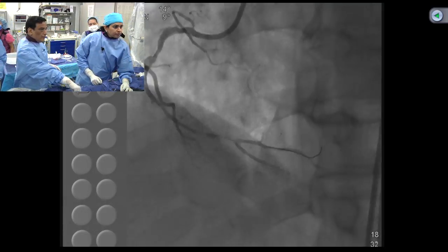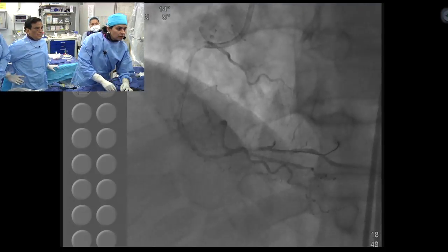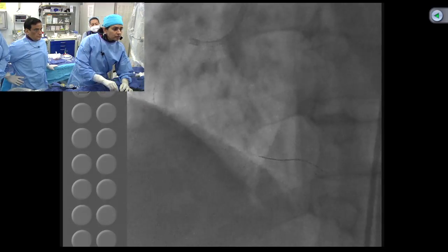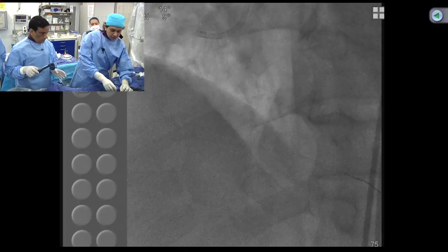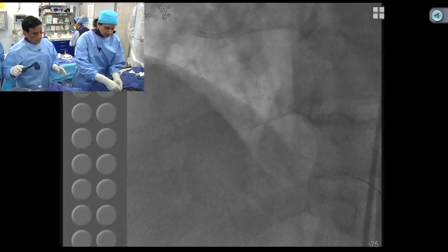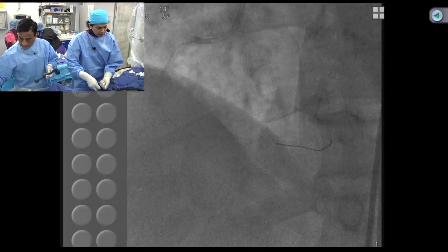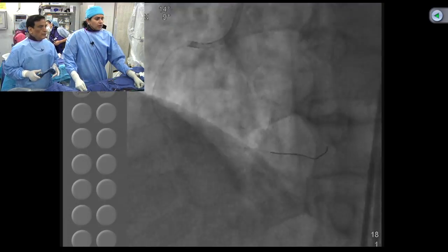Let's try to get a wire into the main vessel and do dilatation. We knew this, we could see it actually at the bifurcation earlier. Do you think the proximal and ostial area needs something too? Yeah, exactly. You want to dilate with this? Distal. This is a 20 millimeter balloon. The lesion is not that long. No, but we have to cover that lesion completely anyway. No, go back, see. You don't have to put those long stents there. Dilate there.